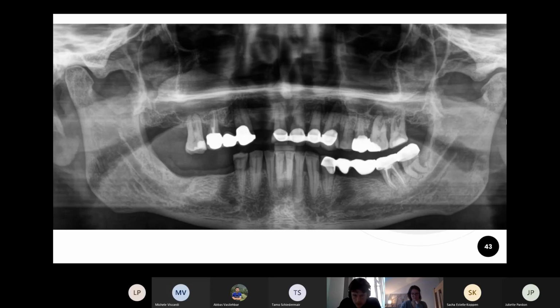Yeah, then you have the extracted 2, and then from 1 till 2, 4, 2, 3, you have the bridge. Metal or ceramic bridge, you should mention. You see the metal caps and the ceramic on top. 4 looks fine. 5 is a crown, full metal crown. 6 is MO composite, amalgam filling, and 7 is an occlusal amalgam filling.